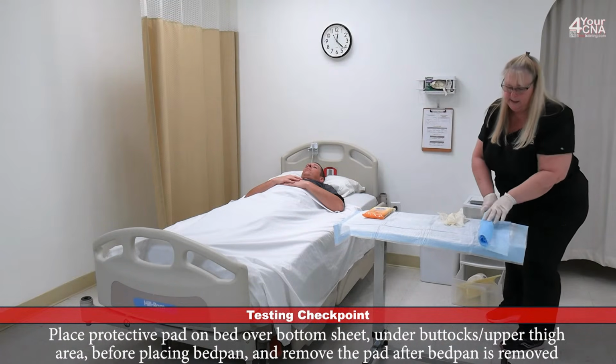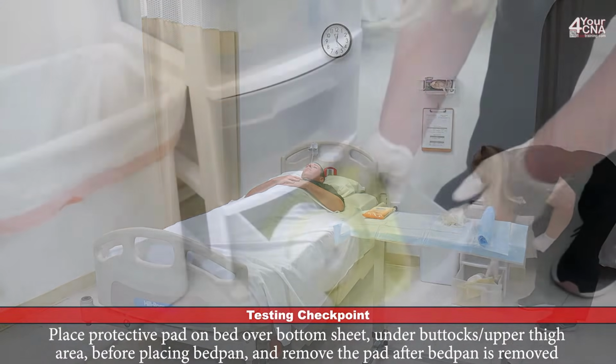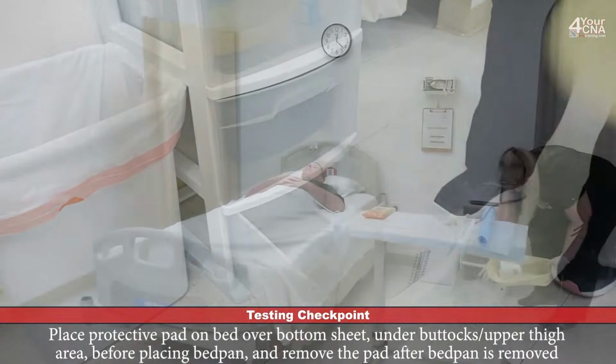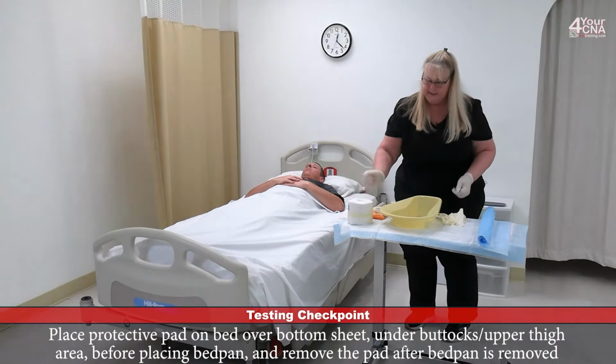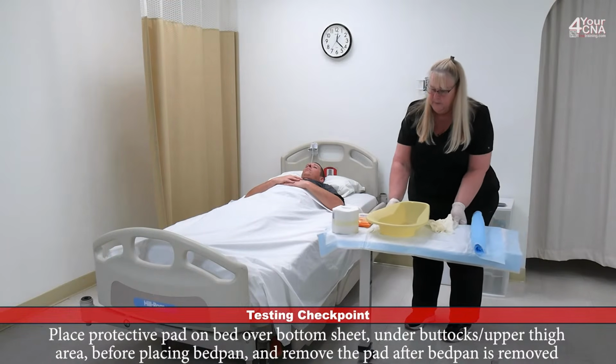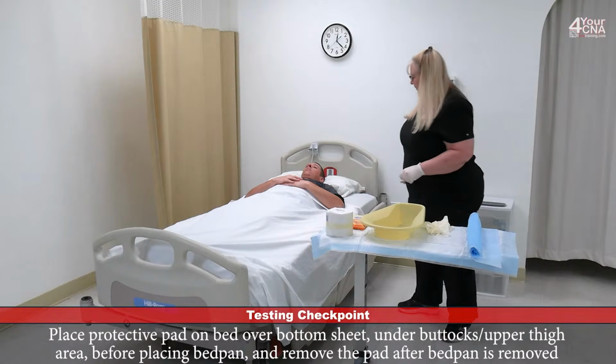And we're going to set that aside. I'll get the bedpan and the toilet paper out of the drawer, and we'll put those on the bedside table. Now we're ready to start the skill.